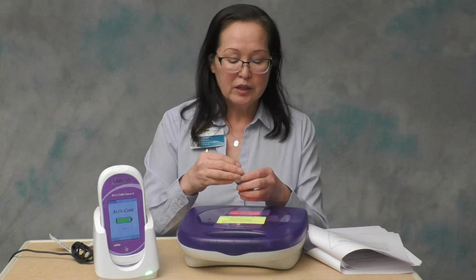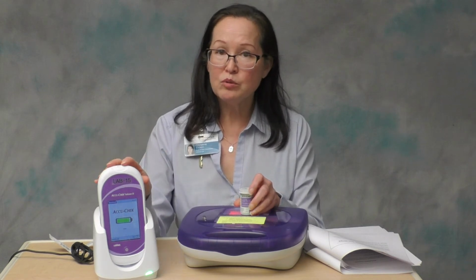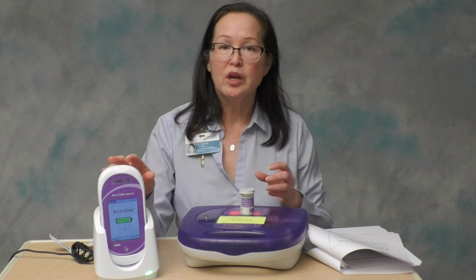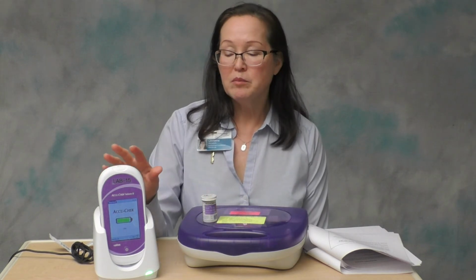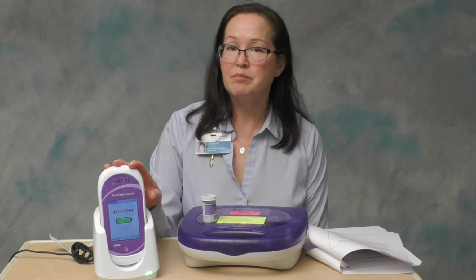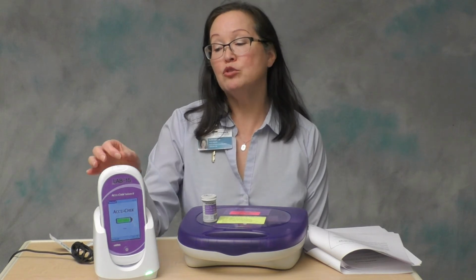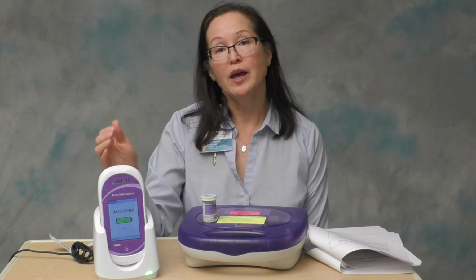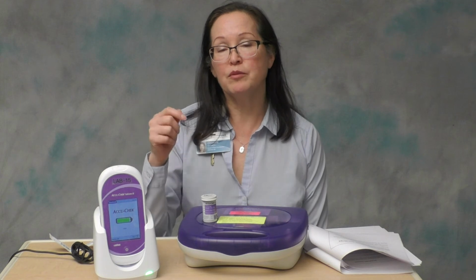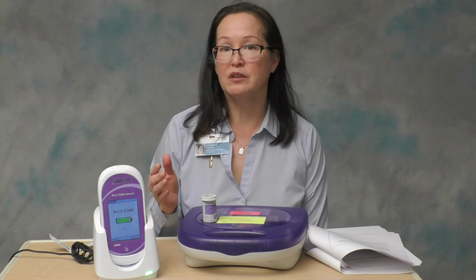And if you insert the strip into the meter too soon or you dose it too soon, you will get one of two error codes. The meter may tell you that you have a bad dose or a strip defect error. If that happens, you can just remove that strip and throw it away. You can put a new strip in, wait for the drop icon to appear before you dose it. This way you don't have to rescan everything that you've done.